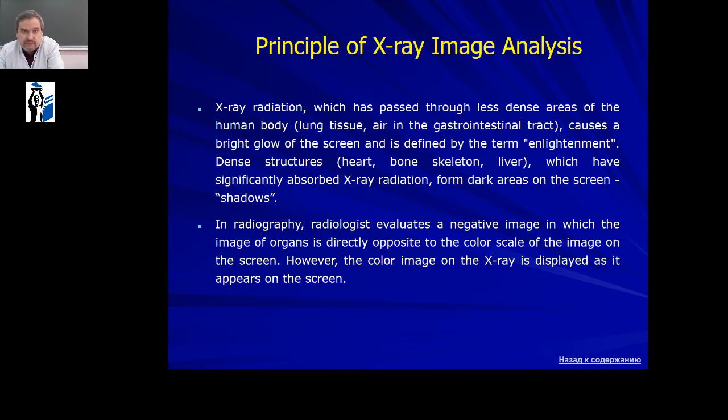Principles of X-ray image analysis. X-ray radiation, which has passed through less dense areas of the human body, lung tissue, air in the gastrointestinal tract, causes a bright glow of the screen and is defined by the term enlightenment.